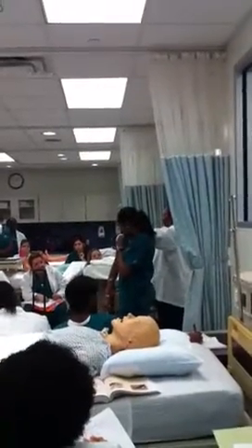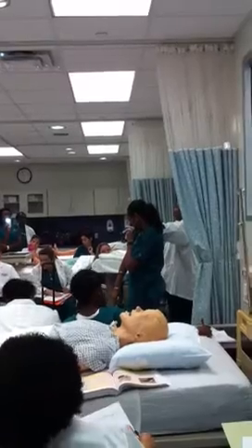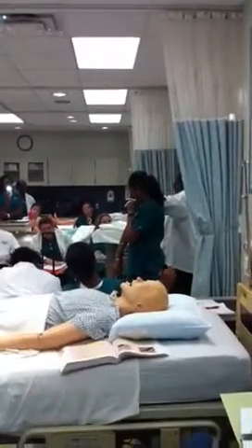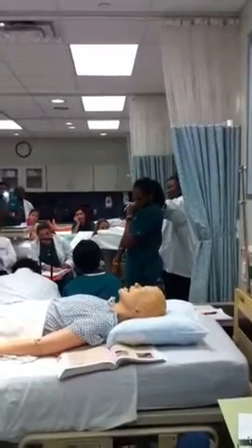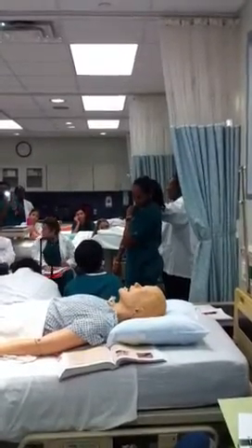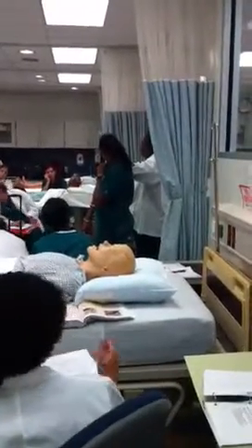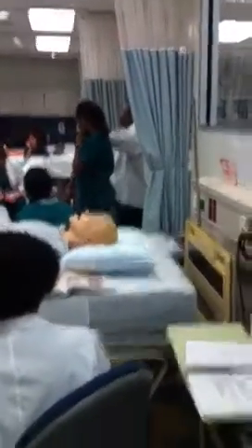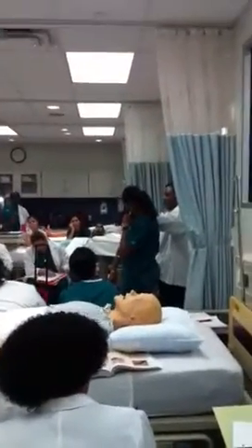Pinch the skin. We see it? Pinch like that. When you're giving sub-Q, why? Because it says subcutaneous. We want it under the skin. By me pinching, the muscle is way down there somewhere, right? Pinch the skin for sub-Q. Any sub-Q you're giving, you pinch. If I'm going to give IM to get it into the muscle, stretch it.